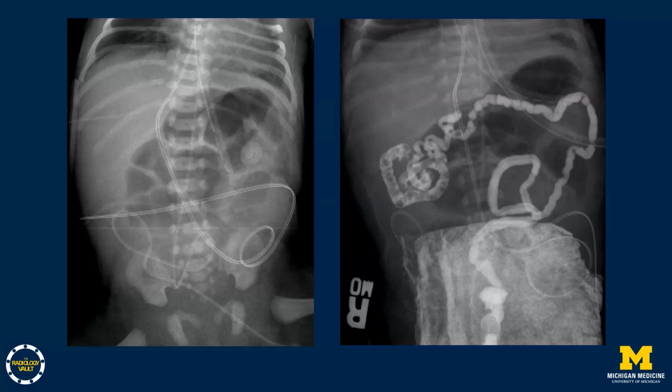And we are now refluxing the terminal ileum, which is within the right side of the abdomen, and it is filled with multiple filling defects. That is the thick, tenacious meconium of meconium ileus. So a nice example of meconium ileus on a contrast enema.